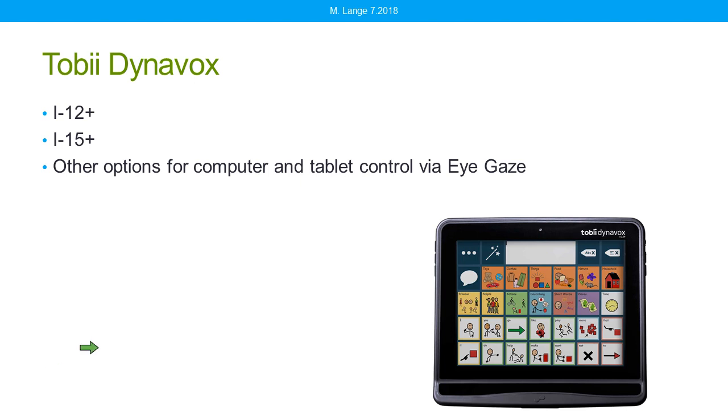Let me get my little arrow here. And in this picture here, the technology, the illuminators, and the camera that reads the reflection of the eyes is down in this bar below the actual display.